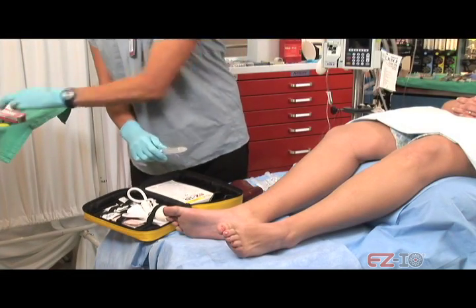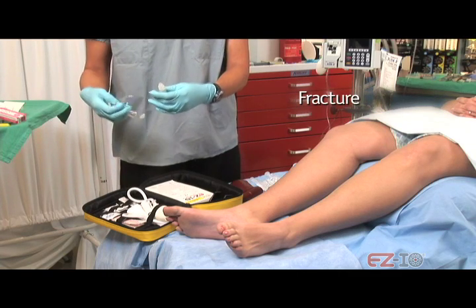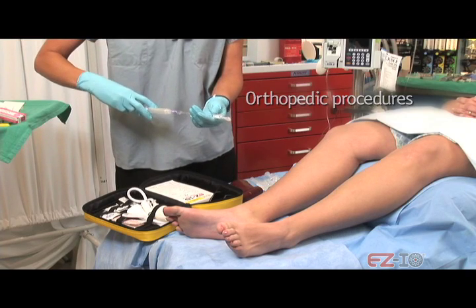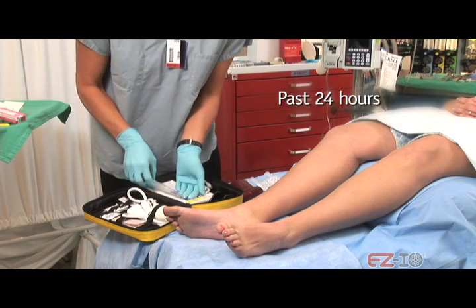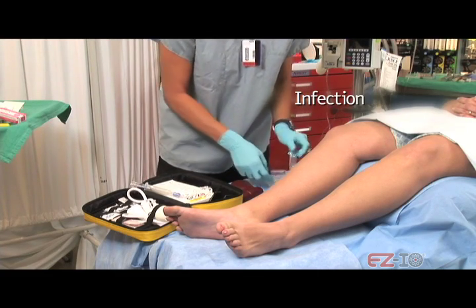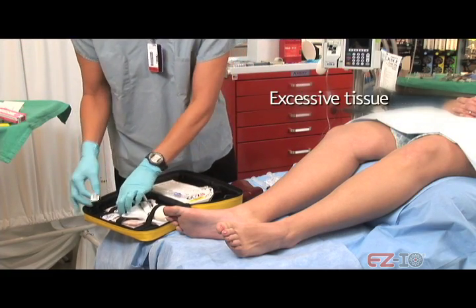The following are contraindications for Easy IO access: a fracture on the targeted bone, previous orthopedic procedures near the insertion site, a prosthetic limb or joint, IO has been used within the past 24 hours on the targeted bone, infection at the insertion site, or an inability to locate landmarks or excessive tissue.